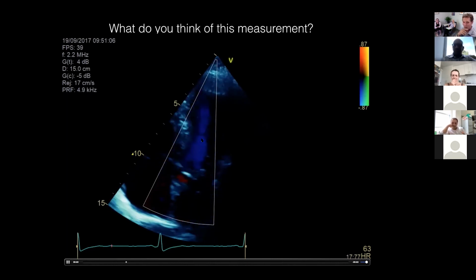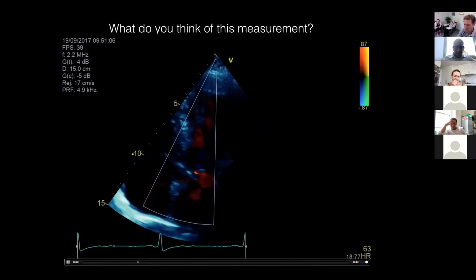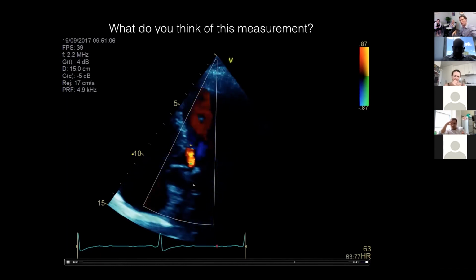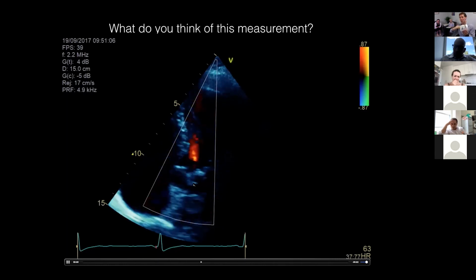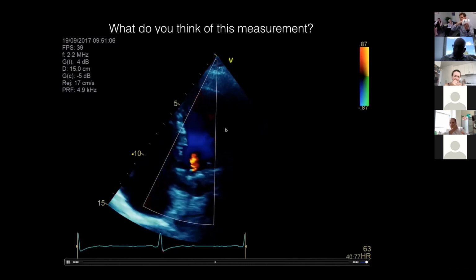But the next thing, and what I learned from Faraz, is do you see how it gets cut off? It looks like we might have some form of chaotic motion there, but I've kind of cut it off. There's the 5-chamber view. You don't have any, Faraz called it bleed, any color Doppler bleed going into the ascending aorta. And what that might tell you is that, let's say this is the ascending aorta and there's the aortic valve. What this picture might tell me is that I'm cutting it at an angle, right? Because it gets closed off at the top. And that might mean that my Doppler angle might be in alignment in the plane that I can see in my picture, but it's not in alignment in 3 dimensions.